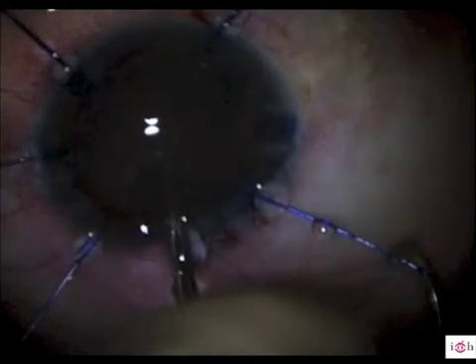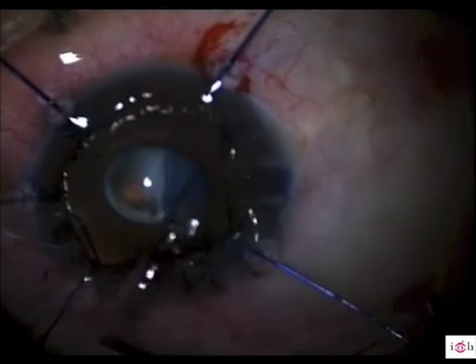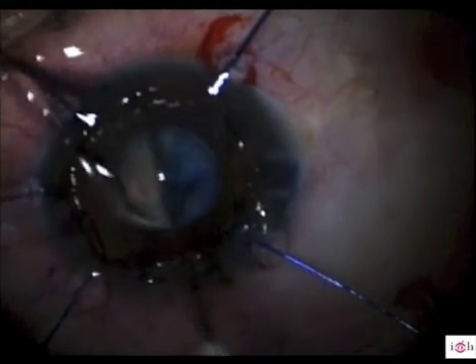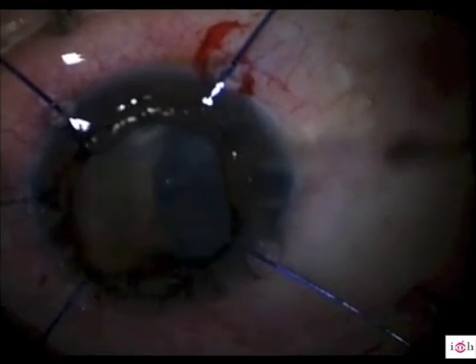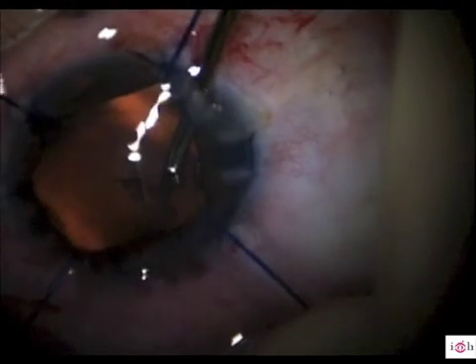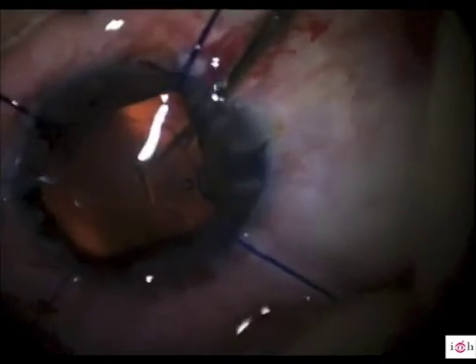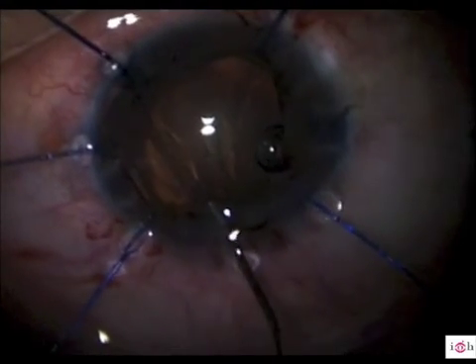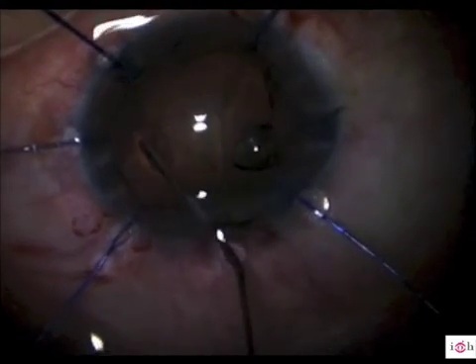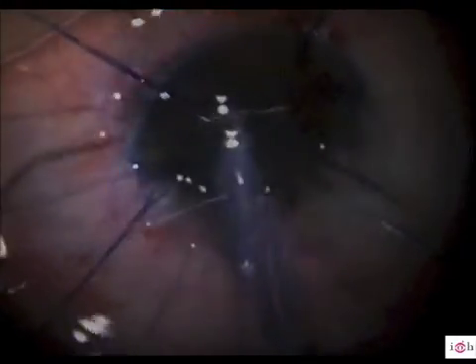Because of the great loss of corneal transparency, it was very difficult to continue with the surgery. We decided to remove the corneal epithelium and put visco on the cornea. This was the key to completing the capsulorhexis successfully. Then, as in any current phaco surgery, we performed the hydrodissection, hydrodelamination, and phacoemulsification of the crystalline lens.